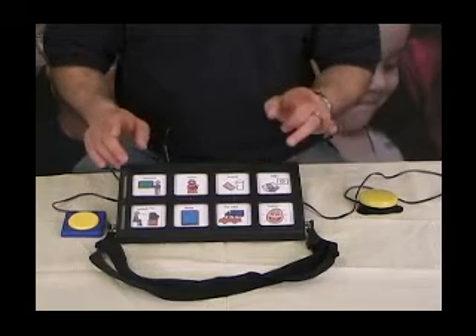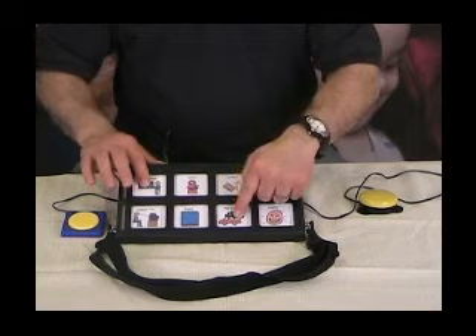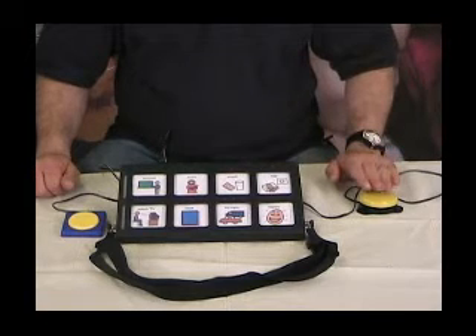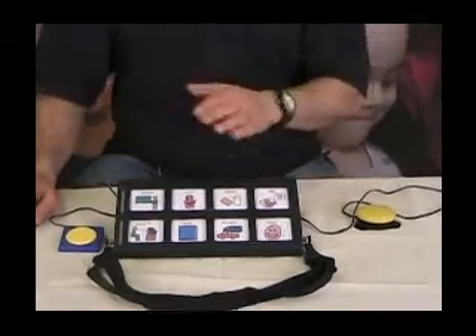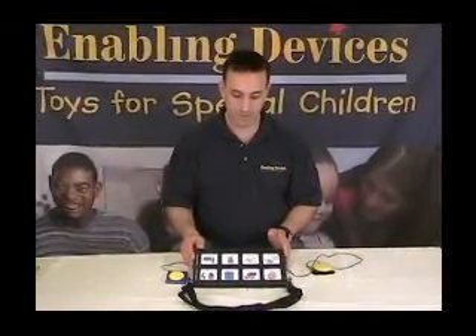The last mode is step scan with two switches, indicated as mode four. Each time you hit the first switch, the machine advances to the next message one icon at a time. Once you've made your selection, you hit the second switch to play it back — for example 'Watch TV.' That covers all the functions of the scanning on this device — every feature and function pertaining to the scan.